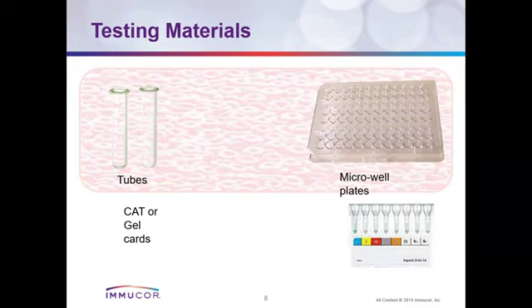I have intentionally decided to omit the tile there for one very good reason: in the event that you are supplied with poor quality anti-D and then you use the tile, you might miss very many things. So try to insist on the tube method if you can, but if you can't, use the tile. But for the weak D that we'll discuss more later, I would not encourage anyone to use the tile. So it's basically the tube method.